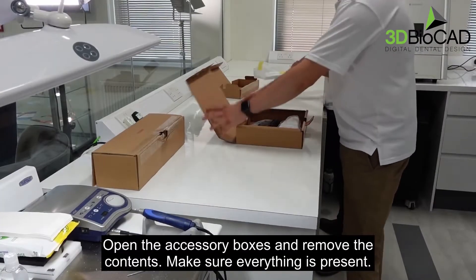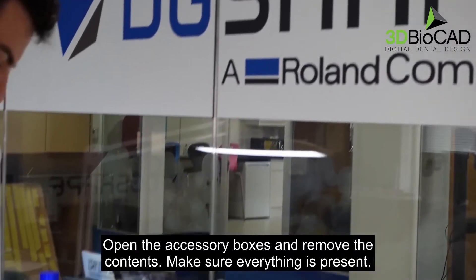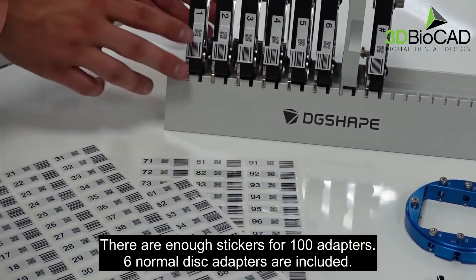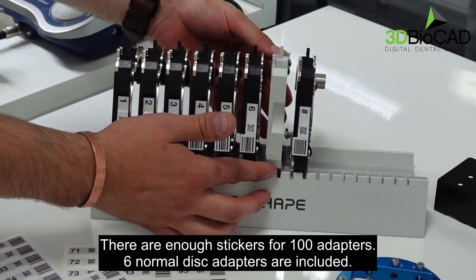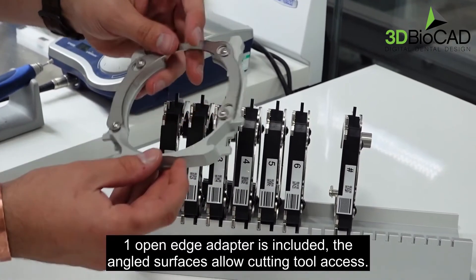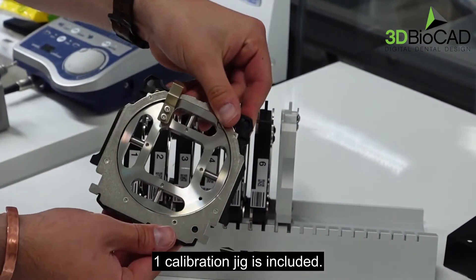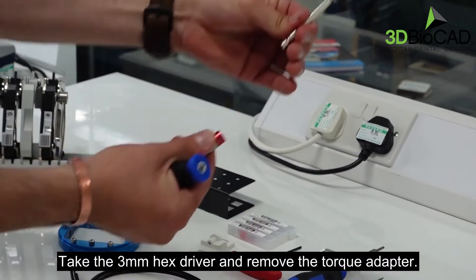Open the accessory boxes and remove the contents. Make sure everything is present. There are enough stickers for 100 adapters. Six normal disc adapters are included. One open edge adapter is included — the angled surfaces allow cutting tool access. One calibration jig is included. Take the three millimeter hex driver and remove the torque adapter.